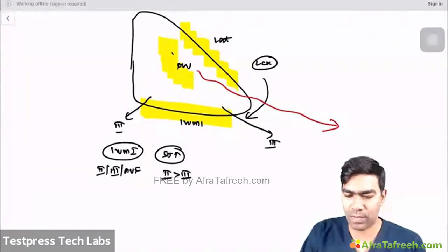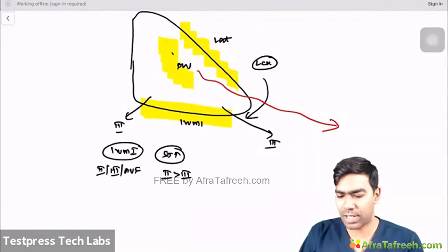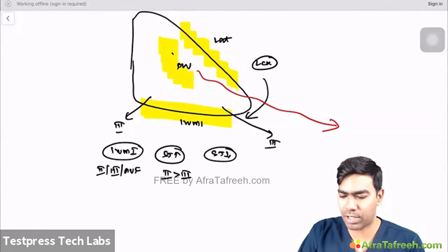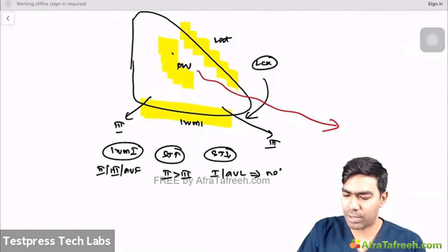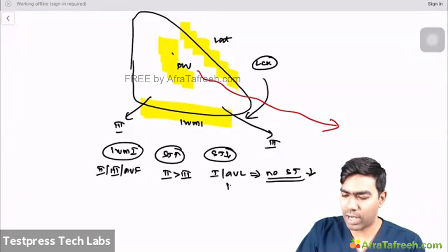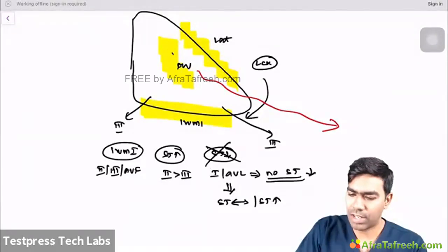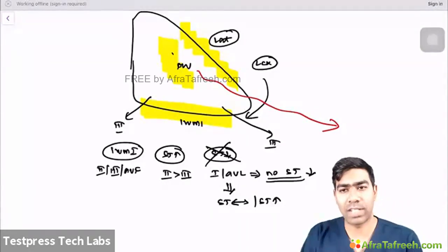If it's an LCX involvement, which is opposite for RCA, lead 2 will have more ST elevation than lead 3. And if you talk ST depression, leads 1 and aVL will not have any ST depression. In fact, in 1 and aVL your ST segment will be either isoelectric, or you can even show an ST elevation if your lateral wall is significantly involved.